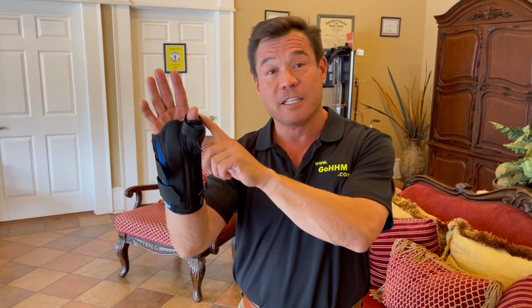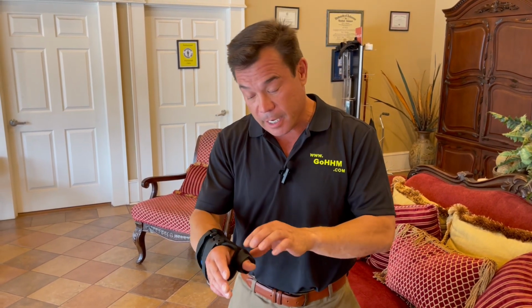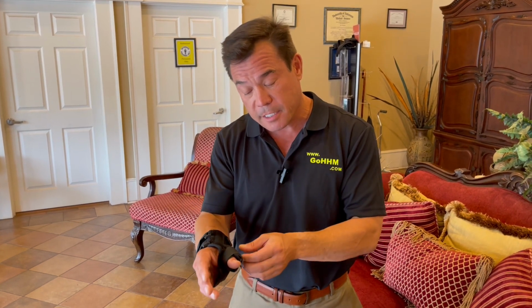Next, same kind of brace, but it's got this addition. This is called a thumb spica. Now, a thumb spica is sometimes called a gamekeeper's or a gamer's thumb, and it's caused by overuse of the ulnar ligament in your thumb. And what happens is the ligament there and the tendons in there become inflamed from overuse, much like carpal tunnel of the thumb. And so this immobilizes it.